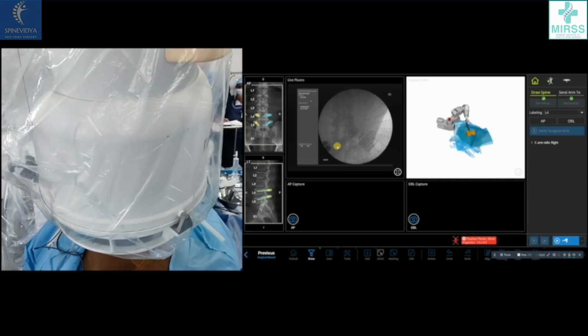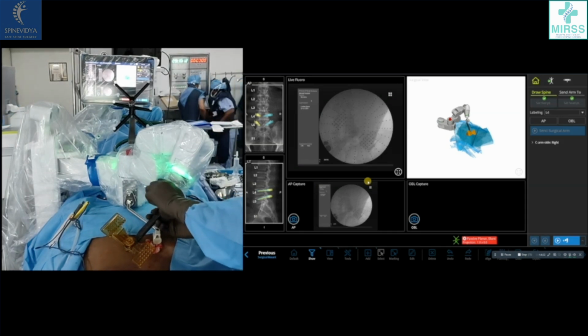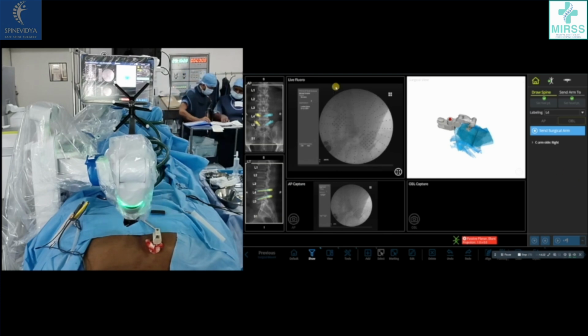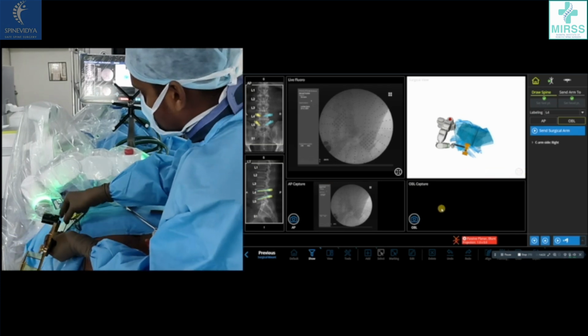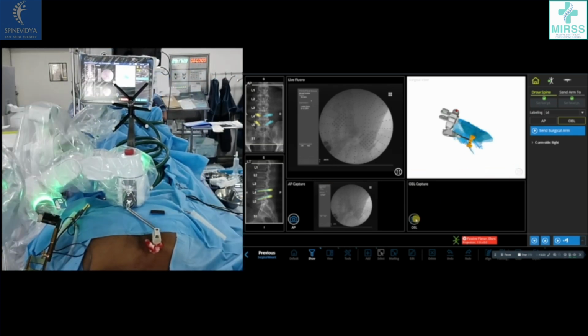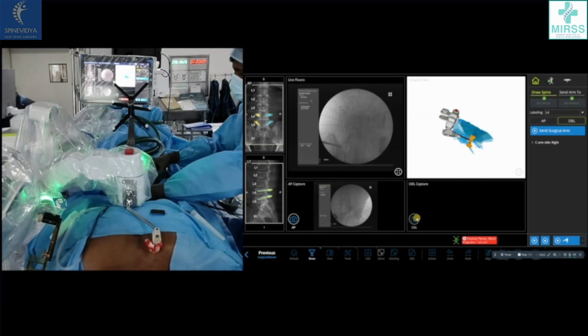The image should cover the fiducial marker along with the region of interest. After acquiring the images and verifying adequacy in the system, the array and extender are removed and the robotic arm is moved to the oblique position. The oblique image is captured with the C-arm at a 65-degree lateral position. The array is adjusted to ensure clear visualization of both the array and the target vertebra.